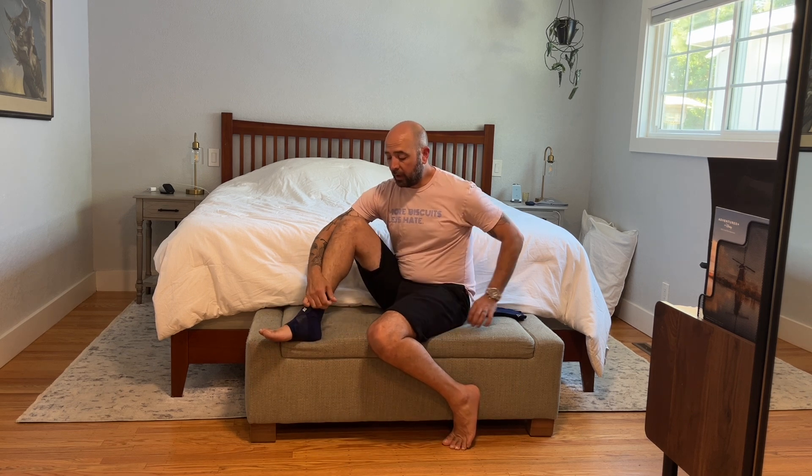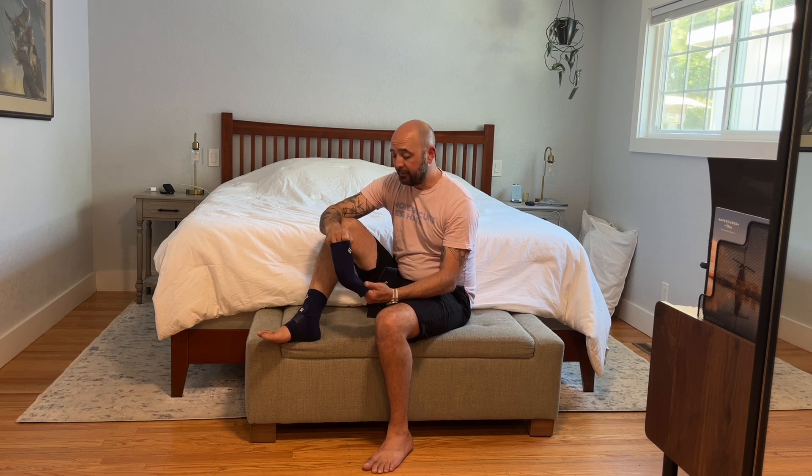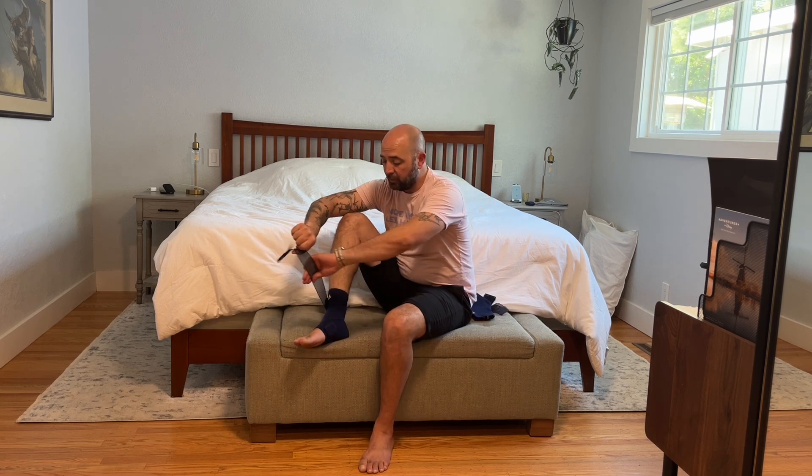They're really easy to put on and to adjust. It comes in two pieces. You want to make sure you get the right size. I'm about six feet tall, I wear a size 13-14 shoe, so I'm definitely at the large size. The material itself is really great. You slide this on and then it comes with a separate support piece — I'll show you guys up close how to use it, but it's really easy. It's just a matter of wrapping it around; it's pretty intuitive.